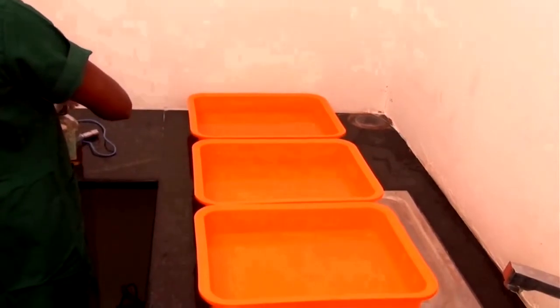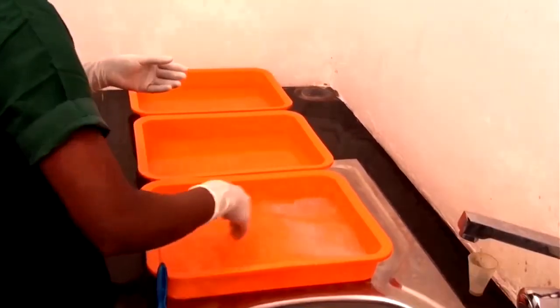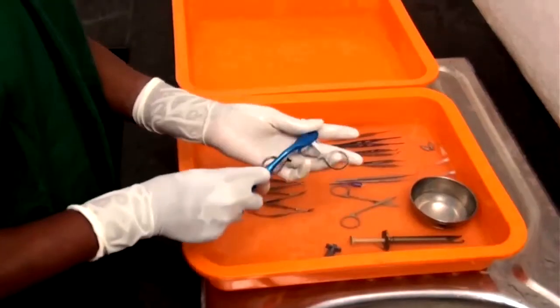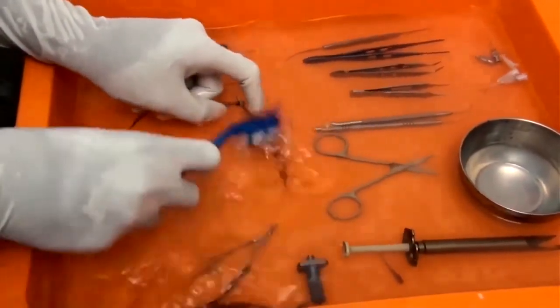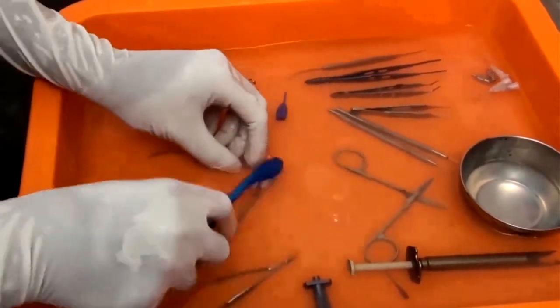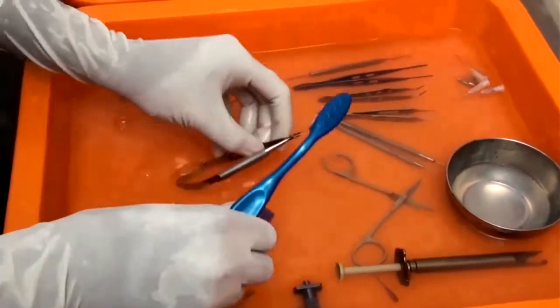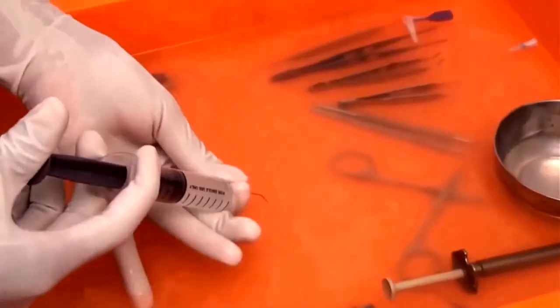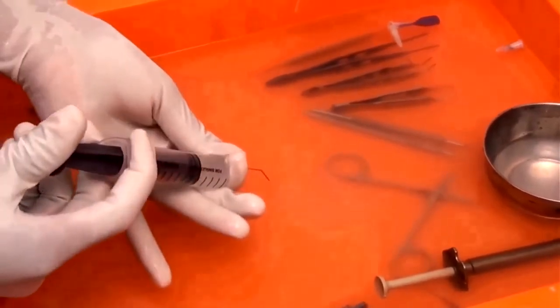Now we'll move on to the cleaning and packing of instruments. Here we follow the three tray technique. The first tray has got the disinfectant. Very mild disinfectant is enough. These other two have got distilled water only. And it is better to clean it inside the solution so that aerosol is not produced while cleaning the instruments. After cleaning in this, it's rinsed in the second tray, and finally all the hollow instruments are flushed clean.